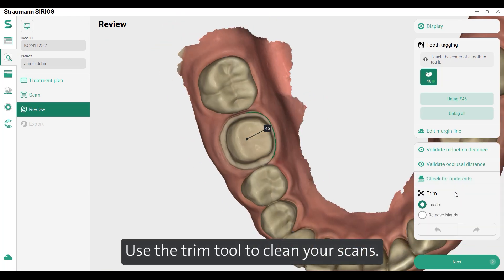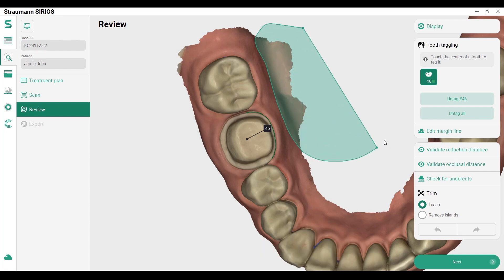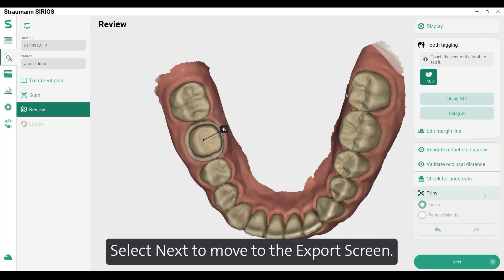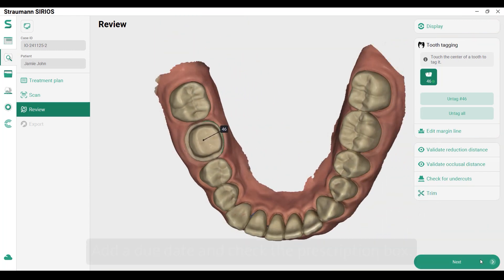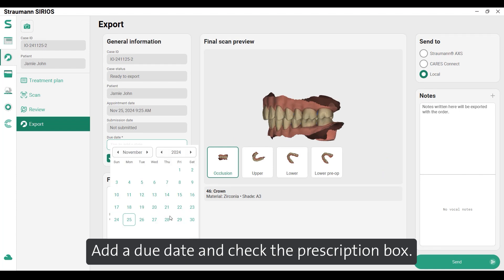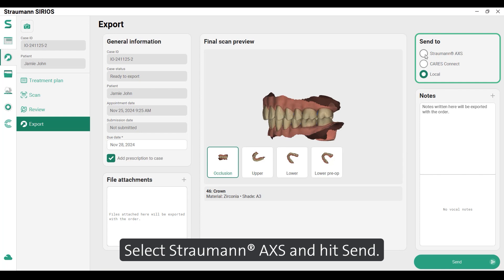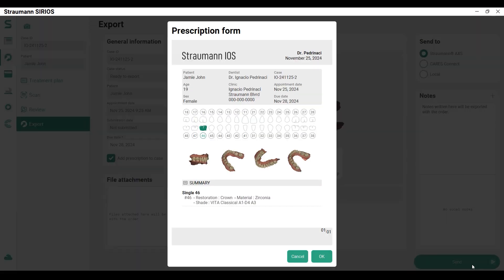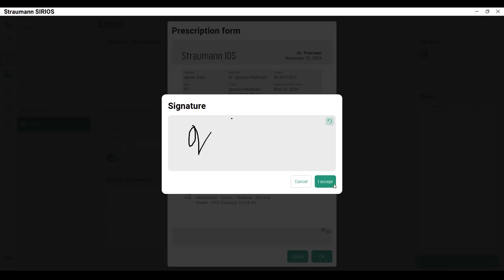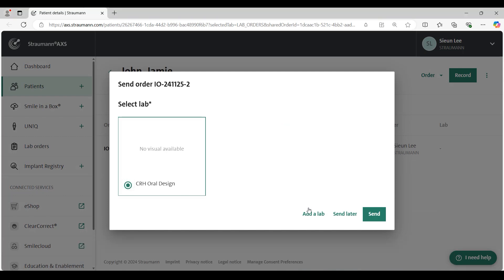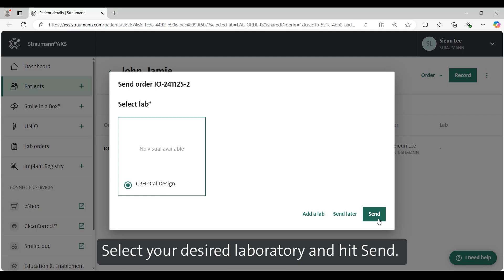Use the trim tool to clean your scans. Select next to move to the export screen. Add a due date and check the prescription box. Select Straumann Access and hit send. Once exported, the Straumann Access platform will launch. Select your desired laboratory and hit send.